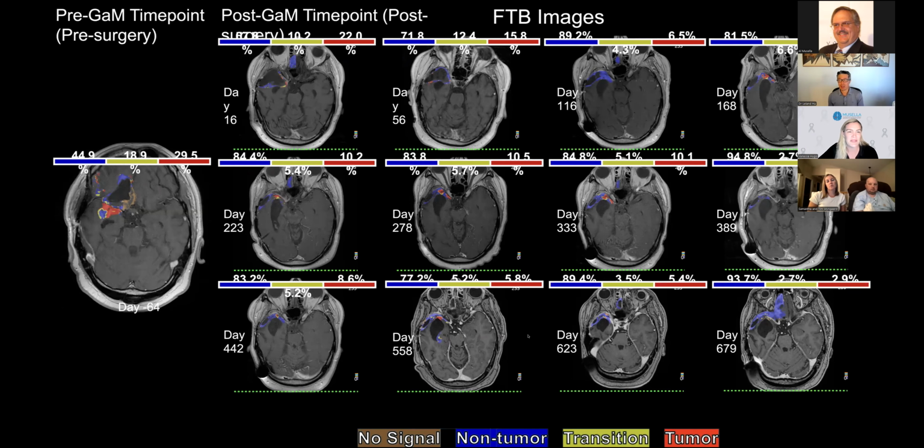Is it being used routinely in clinical practice at some locations? Yeah, I think DSC perfusion, I will say that Mayo in general, Mayo Rochester and Arizona are definitely acquiring it routinely. I think that other groups are starting to use it more frequently. I know Barrow, hopefully other sites. But yeah, I think there's still a ways to go.